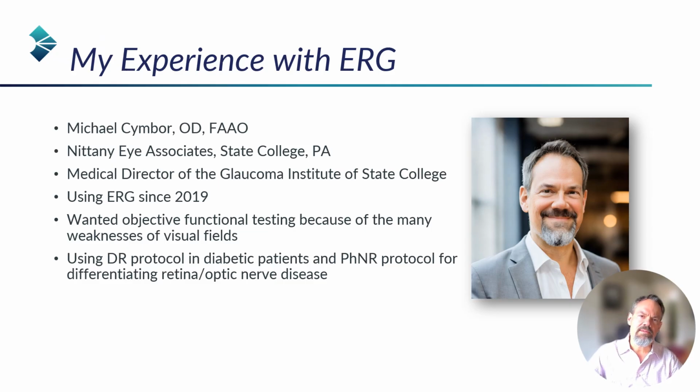I like objective functional testing because we know all of the weaknesses associated with visual fields. I use the diabetic retinopathy protocol in all patients with diabetes, and I use the PHNR protocol to help differentiate retinal and optic nerve disease.